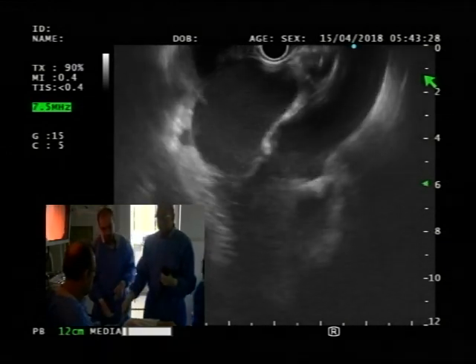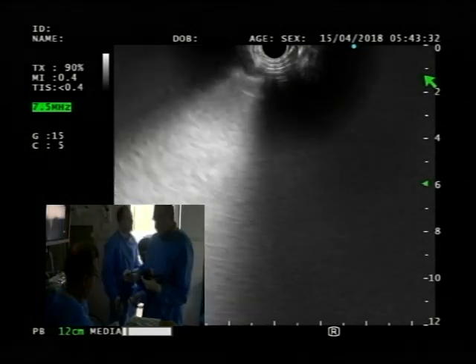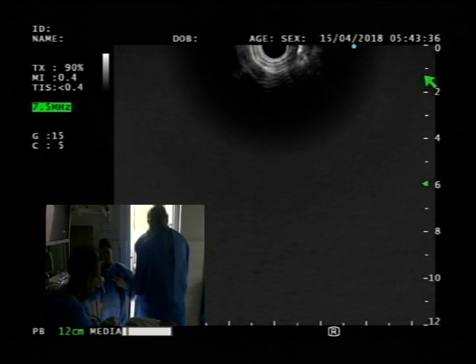Let's come out. Right, thank you. Good. And then there are other smaller vessels. Of course. Still a bit clumsy, isn't it? No, you're not. You're fine.